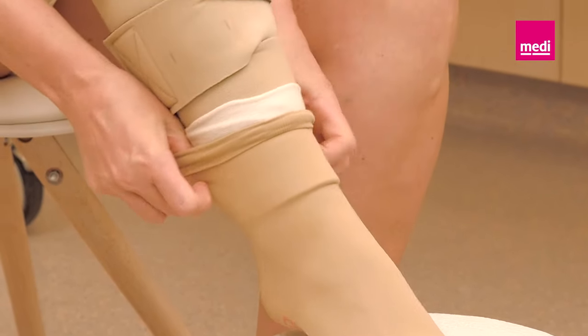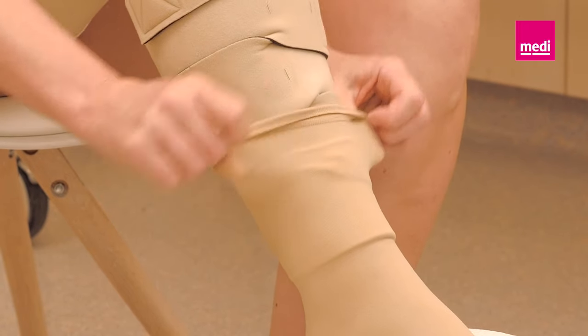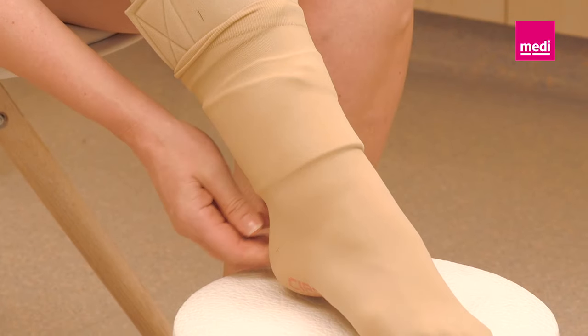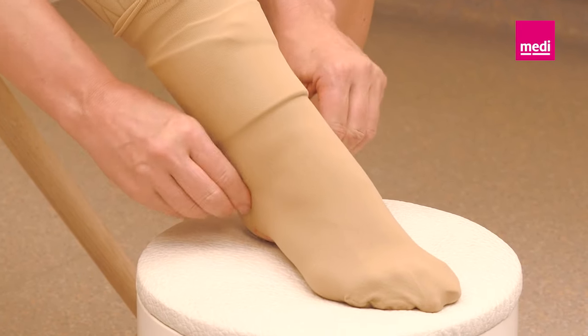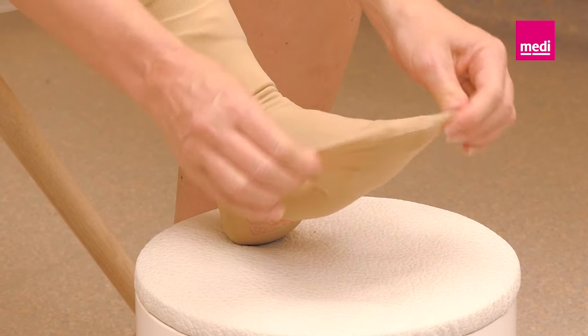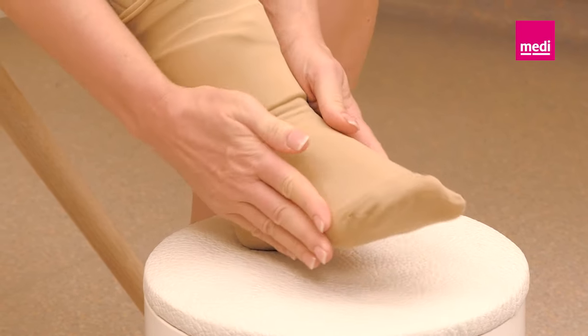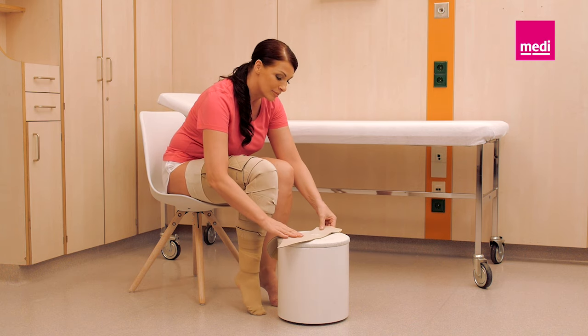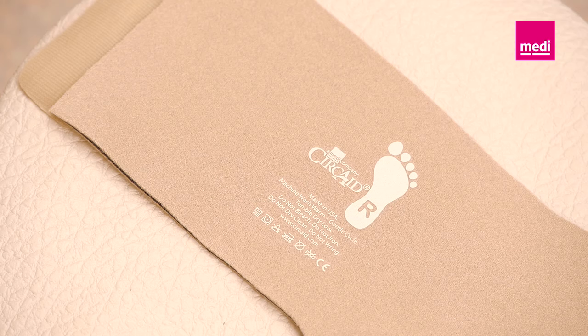Ensure it overlaps with the lower leg component and that there are no wrinkles in the anklet. To apply the foot part, detach the two hook tabs and lay the foot wrap out flat.